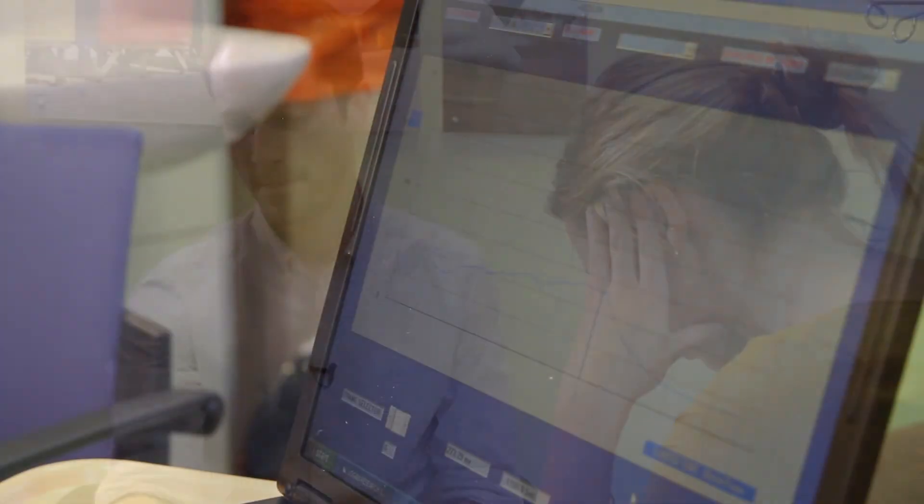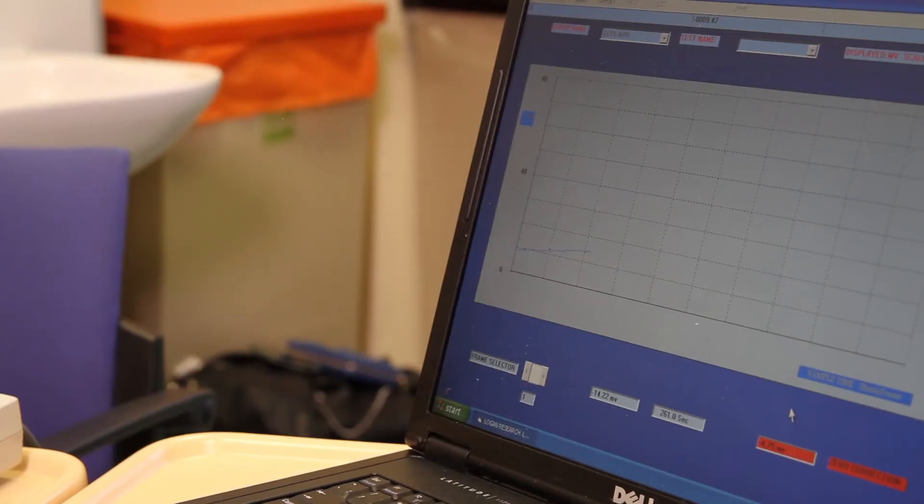The Ringer's phase is now stable, so I'm going to stop that and start the amiloride perfusion by turning the three-way tap. This is now five minutes of perfusion with zero chloride, so I'm going to stop and start the perfusion with zero chloride plus isoproterenol. I'm going to make another electrical mark on the screen and perfuse for a further five minutes.